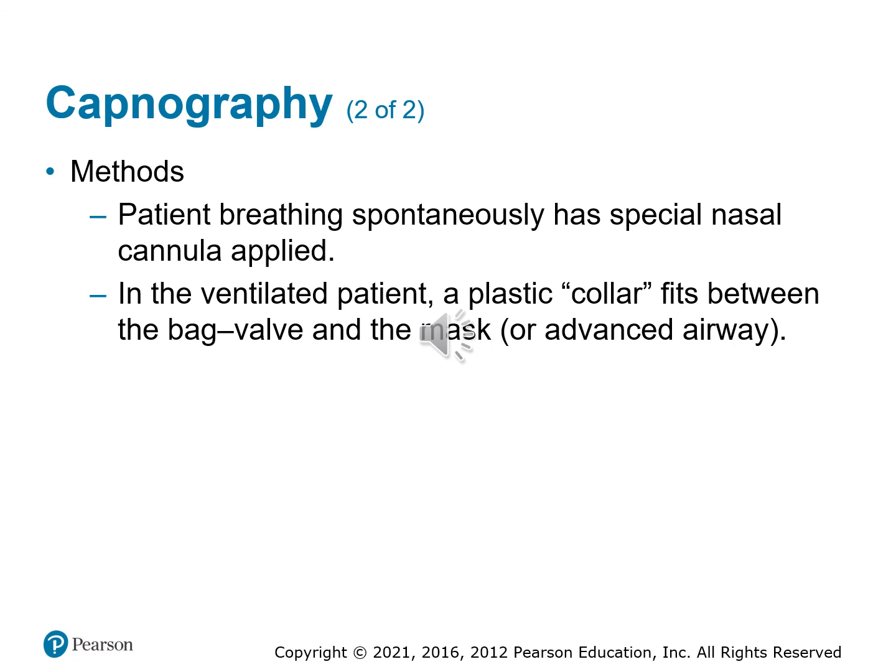However, we can, like I said, still use this in a patient that is not spontaneously breathing, as long as we have an advanced airway in, or you can stick it between the bag valve mask and the actual bag valve. So you would put this little T-piece in there, and then when you squeeze the bag, it's going to push air in. When you let the bag out, that air should still release out of the lungs, and it should still give you a measurement, whether it's an advanced airway or just through the BVM.